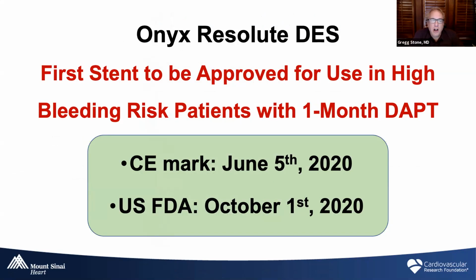And the timing of this talk was actually excellent because it was 2 days ago that the US FDA expanded the label for Resolute Onyx and 1 month of dual antiplatelet therapy in patients at high bleeding risk.